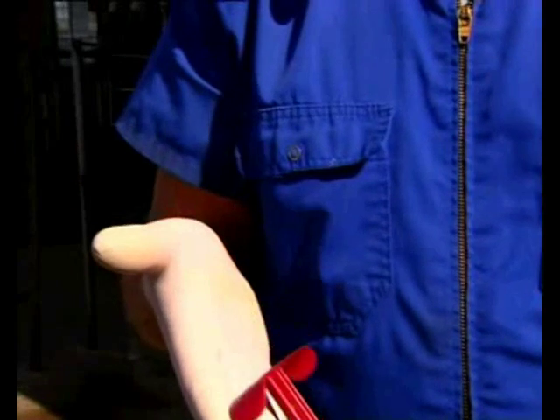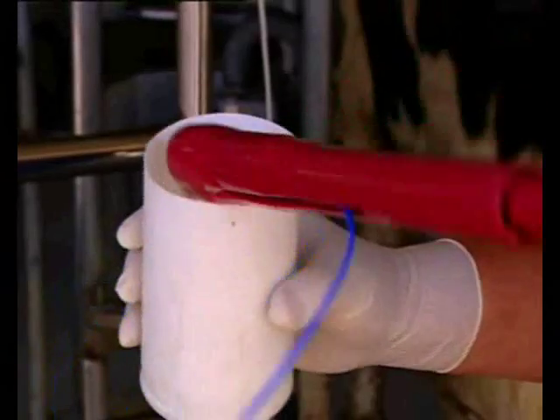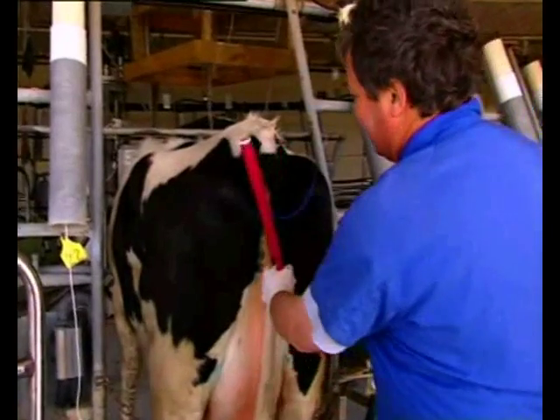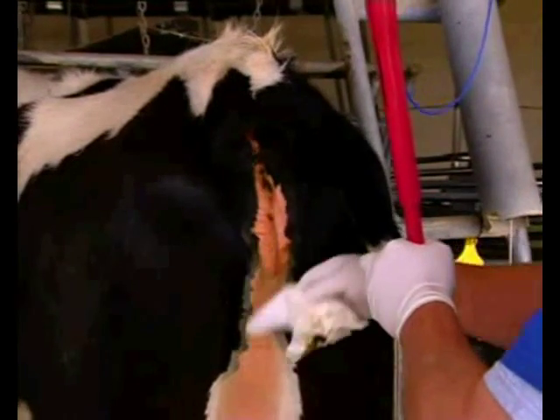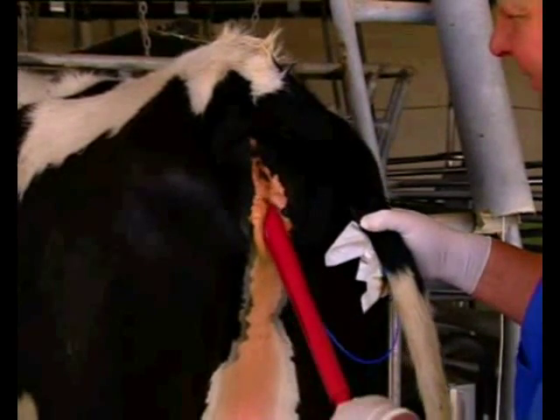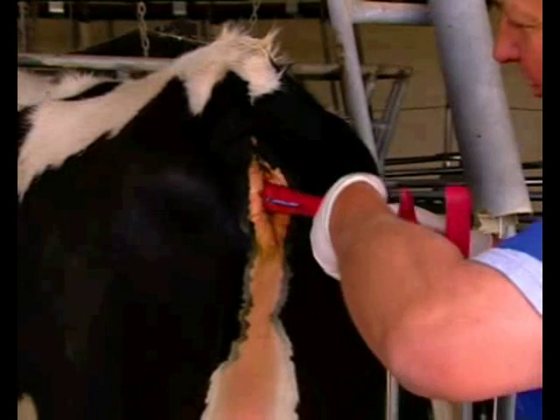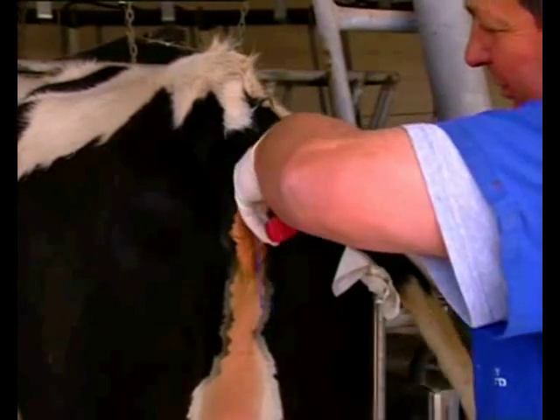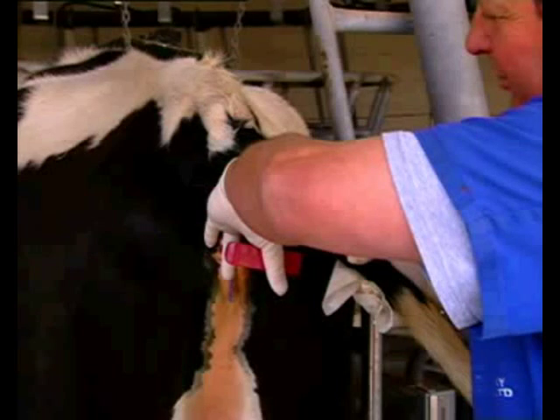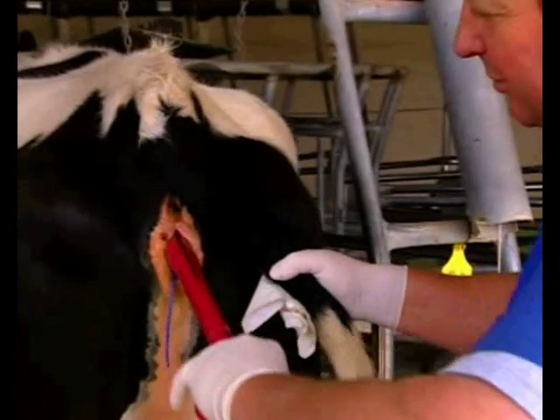The handle is conveniently designed to act as a scraper and a hook. To insert Q-mate, apply veterinary lubricant to the tip of the applicator. Wipe the vulva with a paper towel. Insert the applicator through the vulva lips in an upward and forward motion, turning the applicator into the horizontal position and guiding it well forward into the anterior vagina. Push the plunger to release the Q-mate, then withdraw the applicator.